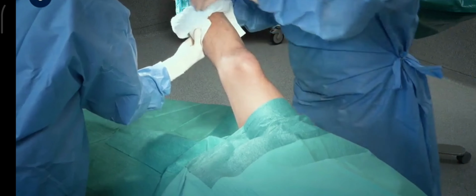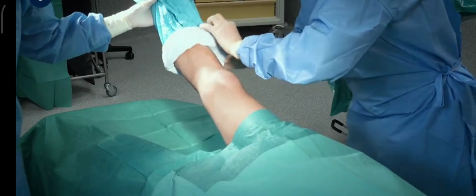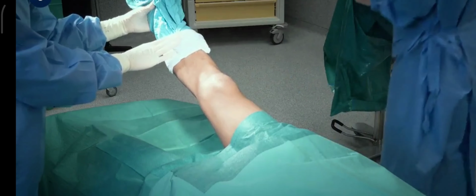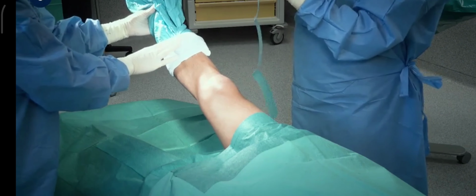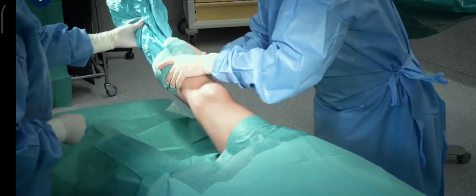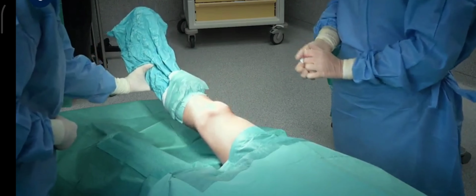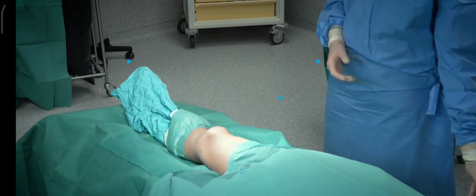The assistant releases the leg, allowing the scrub nurse to pass the stockinette over the unsterile foot and ankle, with the surgeon now supporting the lower limb via the stockinette. The scrub nurse finalises pulling it over the leg and sticks it into place. With the stockinette now safely secured to the patient's limb, it is lowered by the surgeon. Draping of the lower limb with the U-sheet and stockinette is now complete.